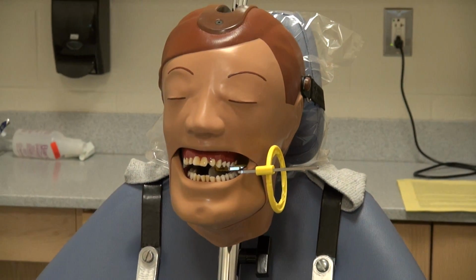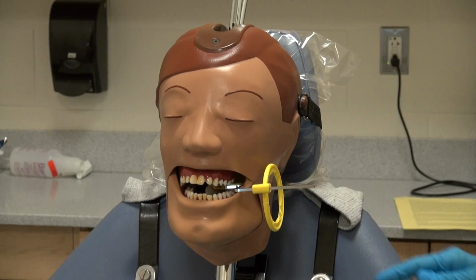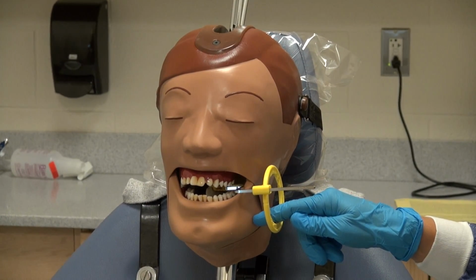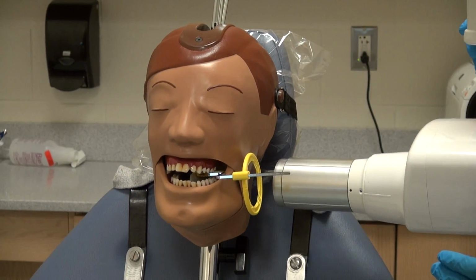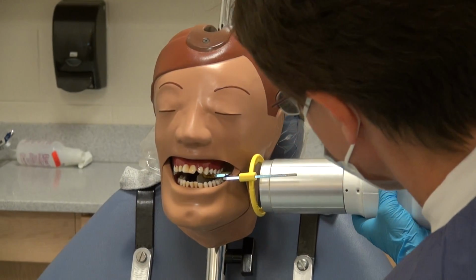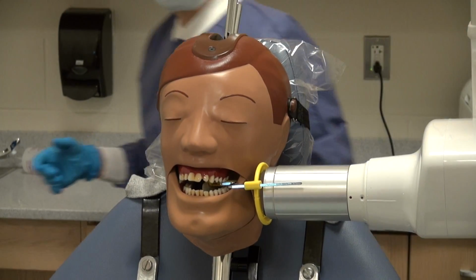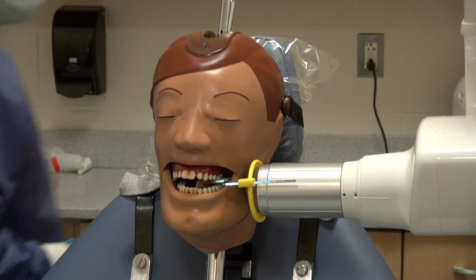The central beam should be directed through the contact area between the first and second molars. The point of entry would be the outer canthus of the eye, dropping straight down and rolling just over the inferior border of the mandible at the height of the apices. We should see this area within the center of the ring. Align the vertical and horizontal angulations and bring to the ring. Evaluate and exit the operatory to make the exposure. Clear! Quickly go in and remove the film from the patient's mouth.